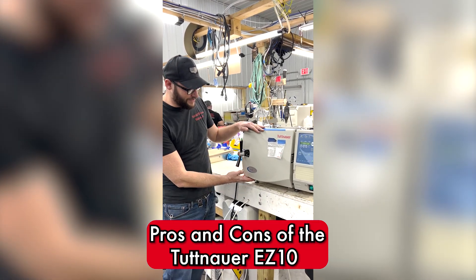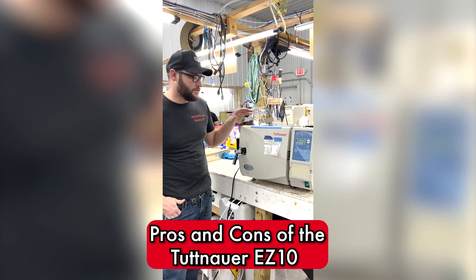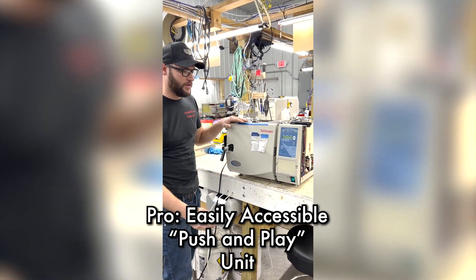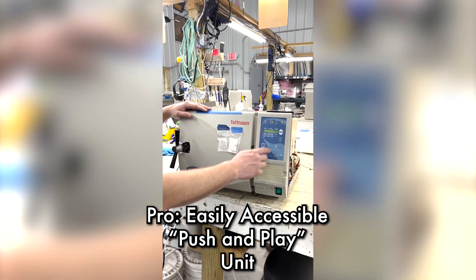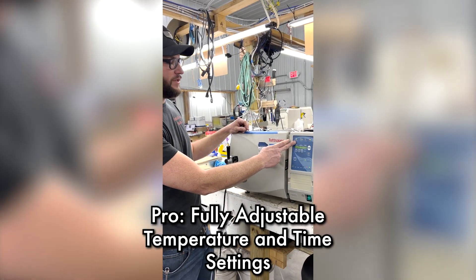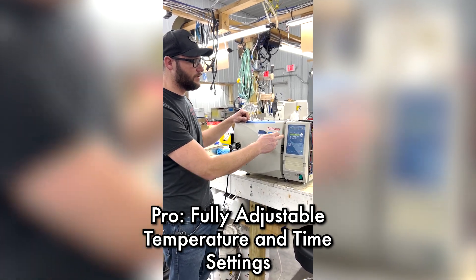Today we're looking at the EZ-10, some pros and cons. The pros are this is a push and play kind of situation — you select your cycle and you press start. You can fully adjust your temperature and time on every cycle.